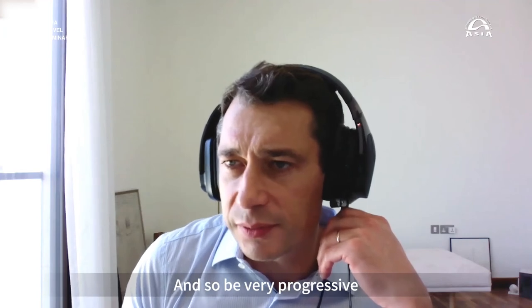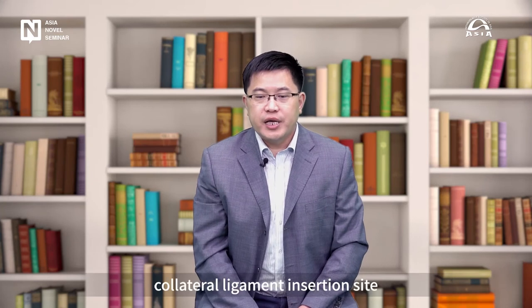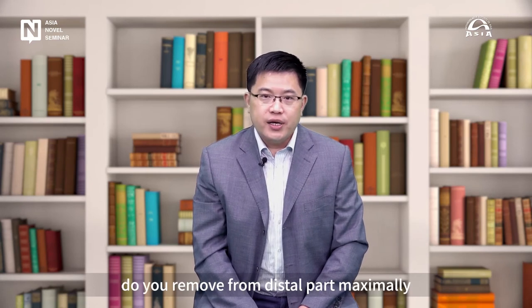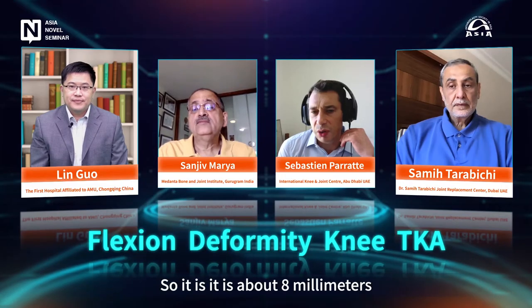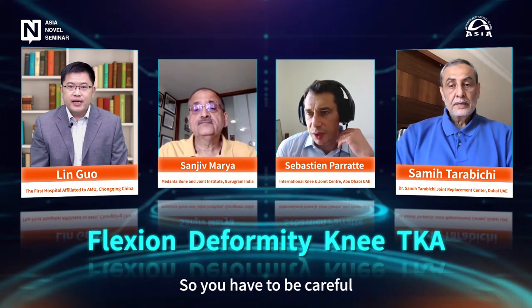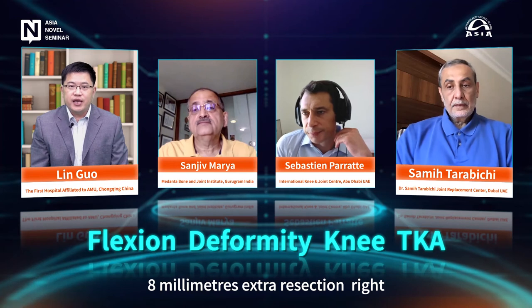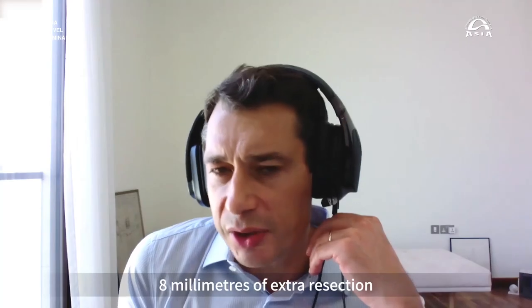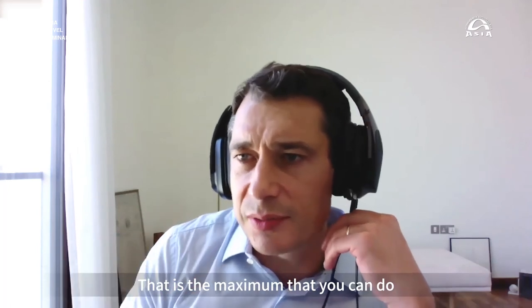So be very progressive. Very good point, never go across the collateral ligament insertion site. And usually for a French population, how many millimeters on average do you remove from the distal part maximally? It's about 8 millimeters. You have to be careful. 8 millimeters of extra resection, that's the maximum that you can do.